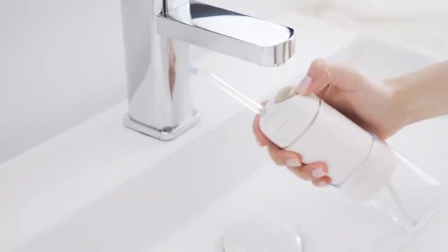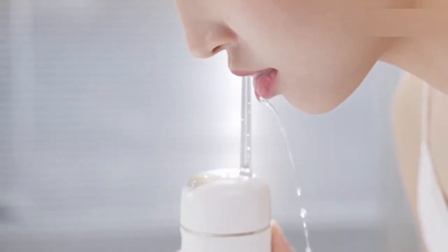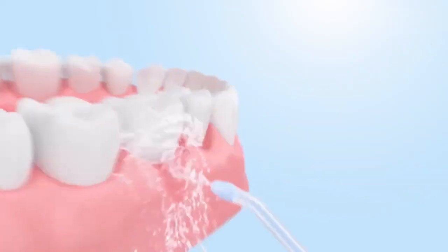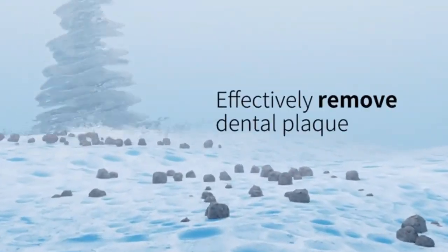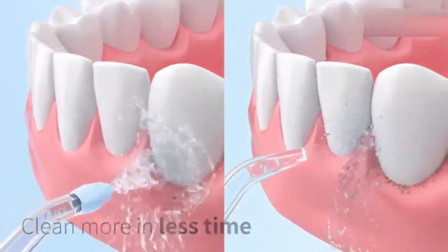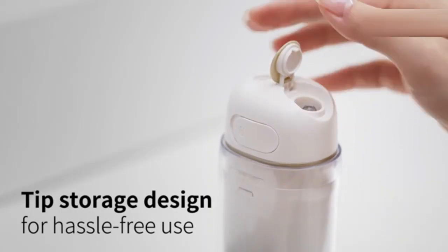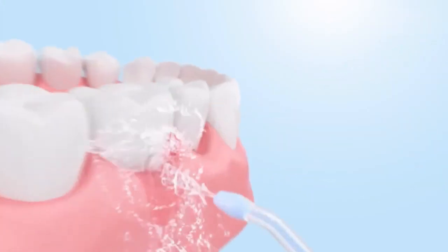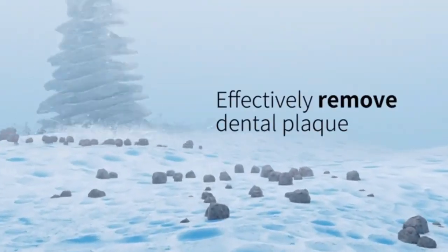Introducing the newest version, the DoGooKoo Water Flosser — your ultimate solution for superior oral care. Featuring three preset modes and 120 DIY settings, it offers a personalized cleaning experience to suit every need. With 5C Nanograde technology, it delivers a deeply penetrating clean, reaching areas traditional brushing misses, ensuring your teeth stay cleaner and healthier. Ideal for sensitive gums and everyday use, this water flosser helps reduce plaque, improve gum health, and leave your mouth feeling refreshed.